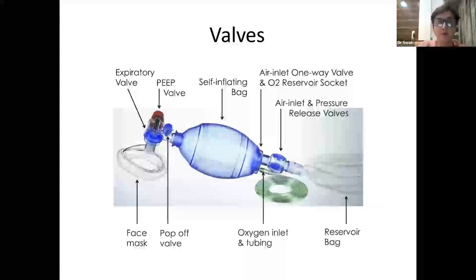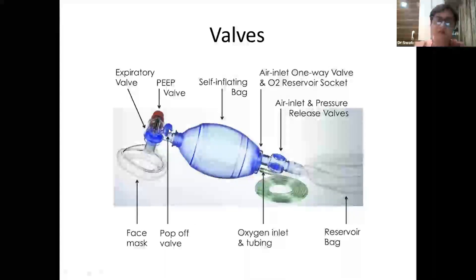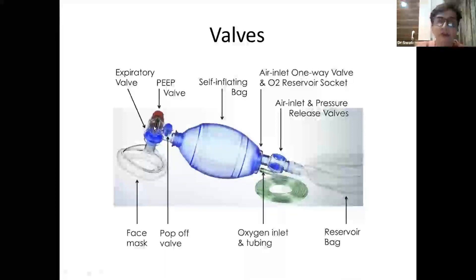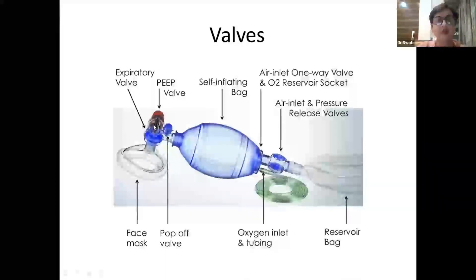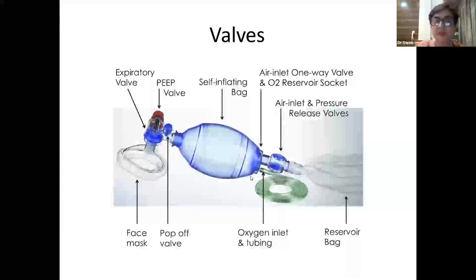There is a pop-off valve which pops off at a pressure of 40 centimeters of water. In some bags there is a facility for a PEEP valve, so we can monitor the PEEP being delivered and provide PEEP. Without this, the bag ordinarily cannot be used to provide PEEP to a spontaneously breathing baby.